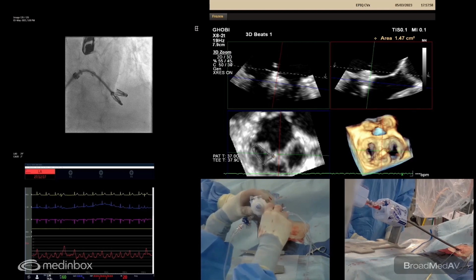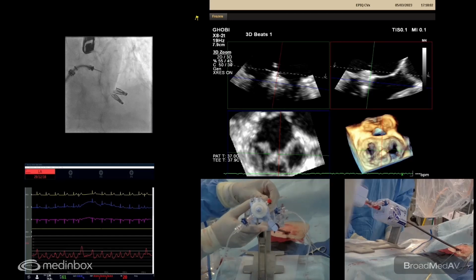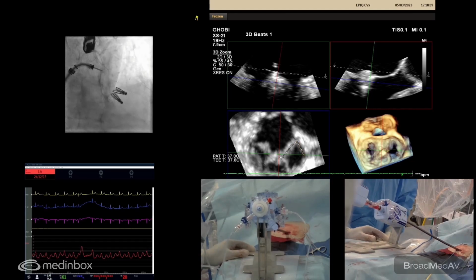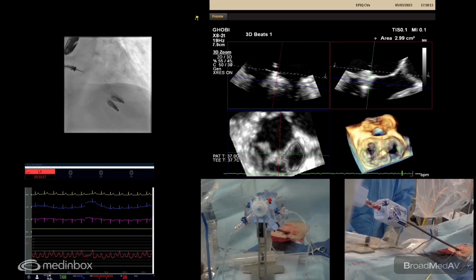7, 8, and gently pull that back. Very good. Pull that back, and now pull the handle back. Perfect. Actually, the handle's already back. Great. Nice. So you want to go live now and show us nothing crazy? You see, cine-wise, both the clips are stable. See that, how nice they are?